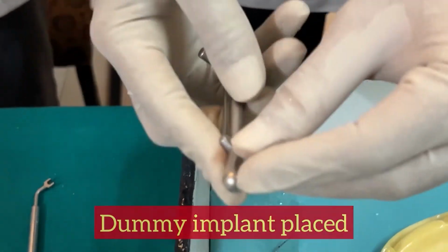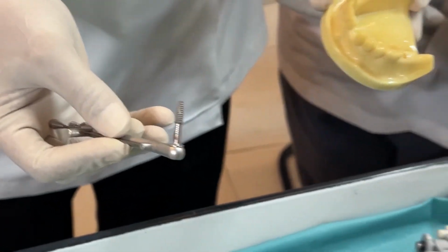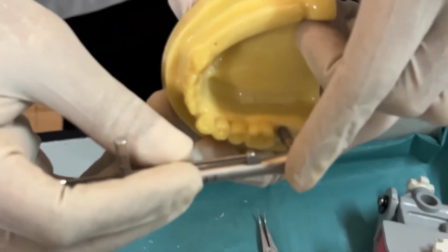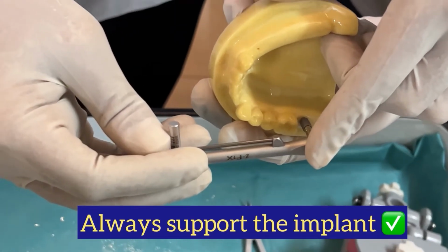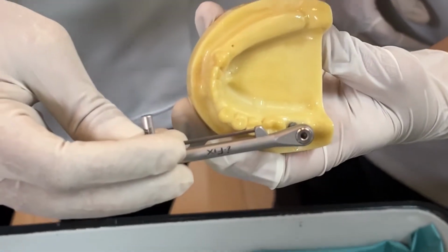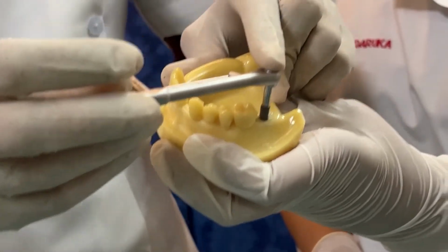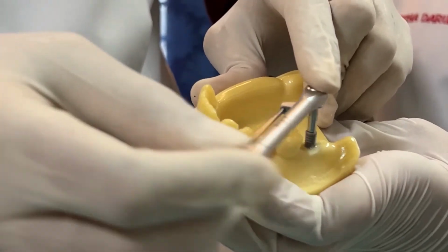This is a dummy implant that we have, and then subsequently now we can please hold it once, start tightening the implant as such. Okay, so now what we do is we engage the implant and we support it with our supporting finger. So always and always in all surgeries, the supporting hand plays a major role. Learn how to retract with the supporting hand, learn how to support your instruments with the supporting hand. So now once we start tightening it, it is going easily.